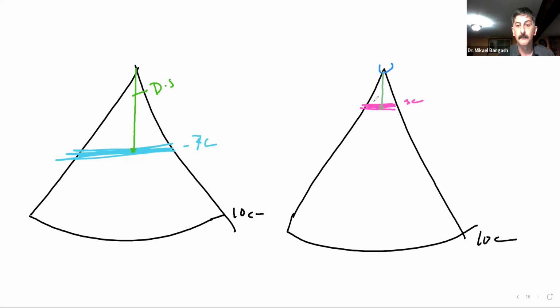Did that make sense? But mainly here, because it's at a lower depth, we can say the PRF for this sample window is going to be increased and reduce aliasing. Is that clear?